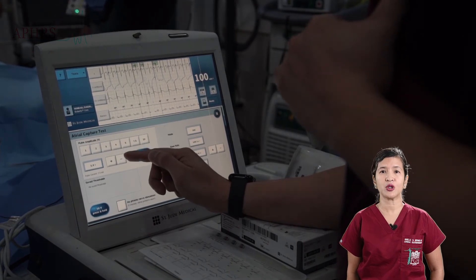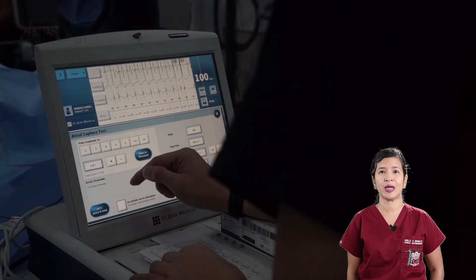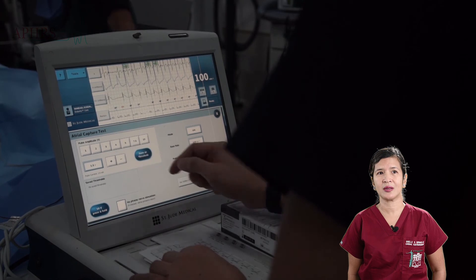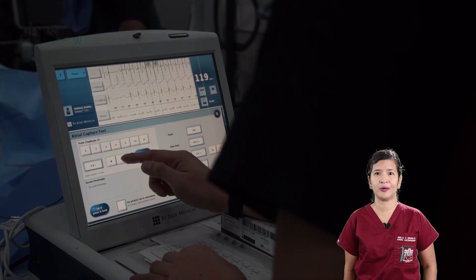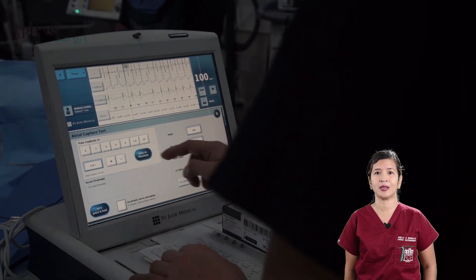The capture threshold is the minimum amount of energy required to depolarize right atrial tissue. In this specific case, there is still capture at one volt. High output testing is similarly done for the right atrial lead to ensure absence of diaphragmatic stimulation.